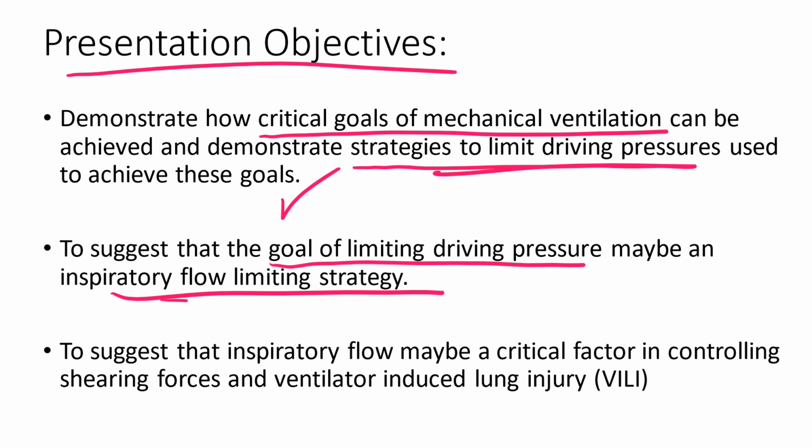Yes, we're always trying to keep the pressures in the lungs as low as possible with our tidal volumes, but maybe a contributing factor to ventilator-induced lung injury is that these inspiratory flows might be a critical factor in controlling the shearing forces that may be responsible for ventilator-induced lung injury, contributing both, of course, to overpressurization. Limiting our P plats is the way we're going to control that.